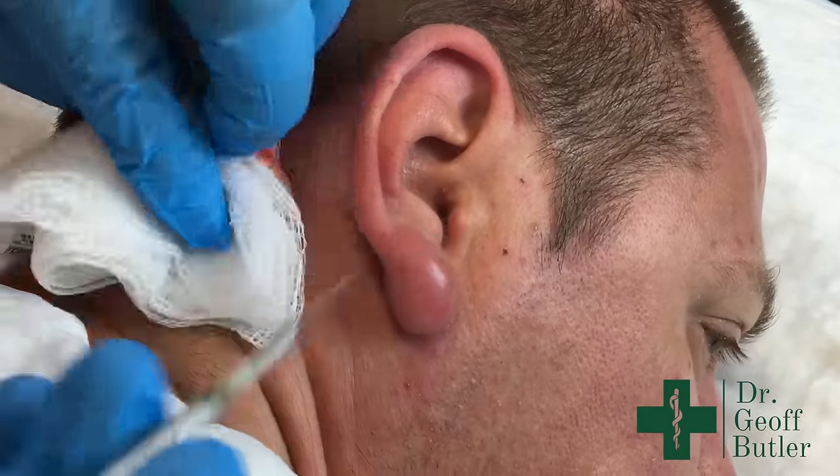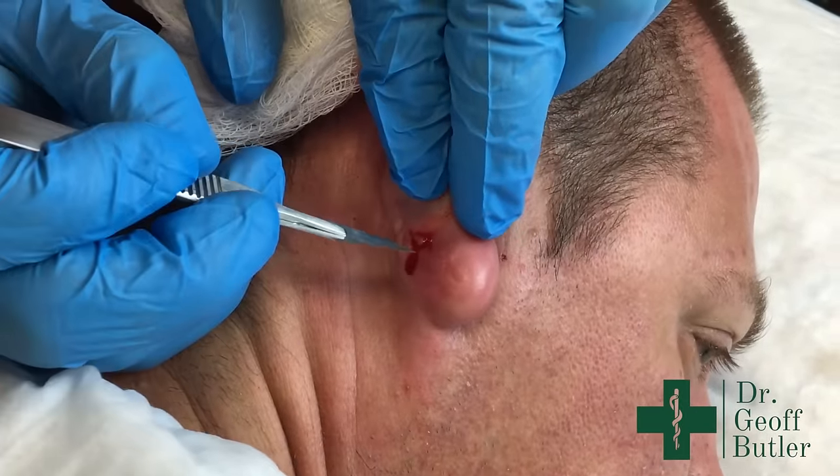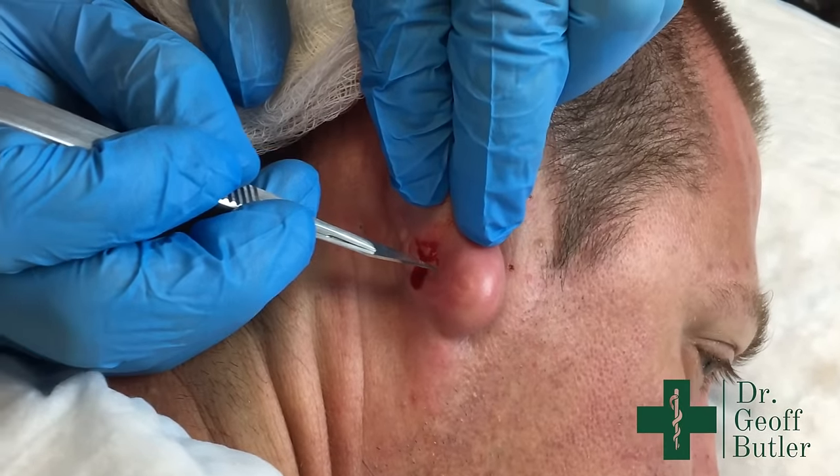When I'm doing incisions for this, I'll use a number 11 blade. I'll just reverse this here and do it gently — just a little poke.